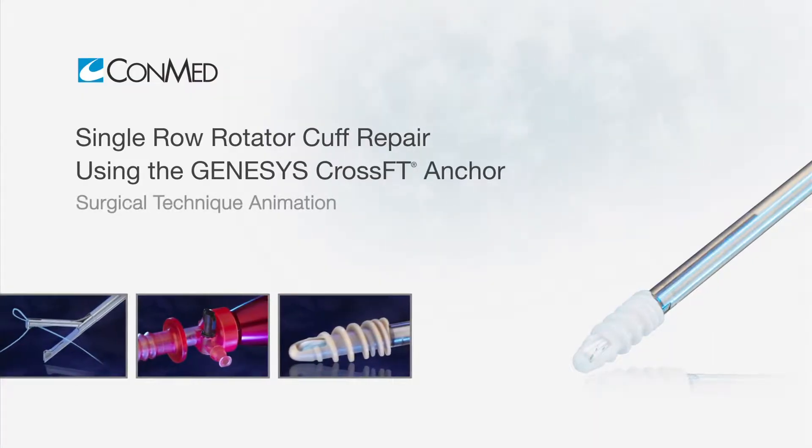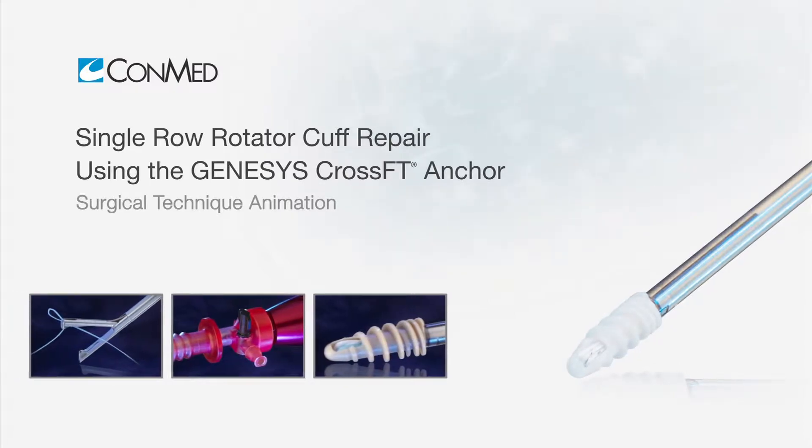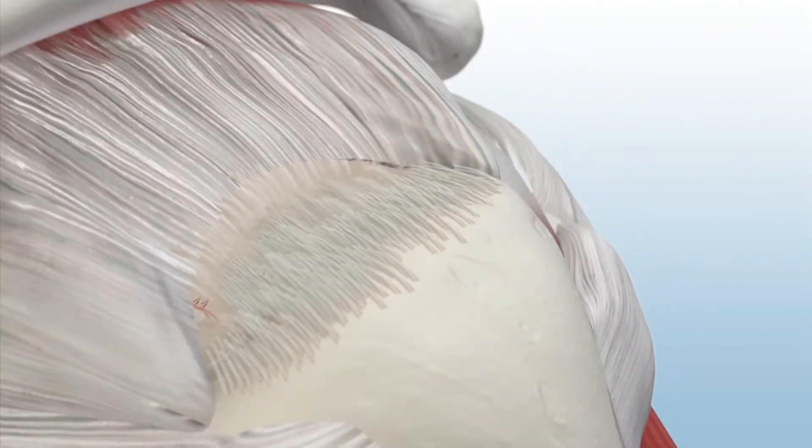The GENESYS CrossFT Suture Anchor uses dual-thread technology to maximize pull-out strength for rotator cuff repair.